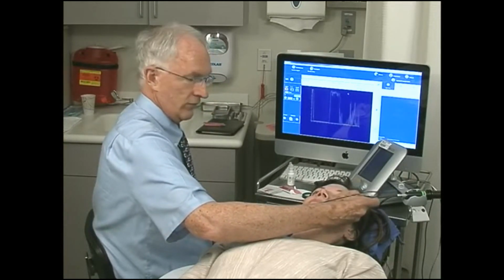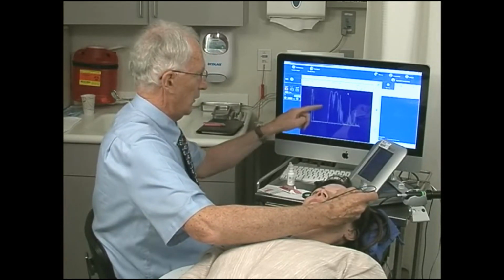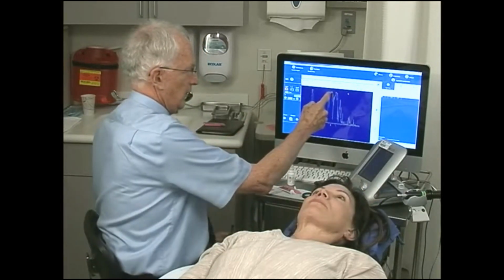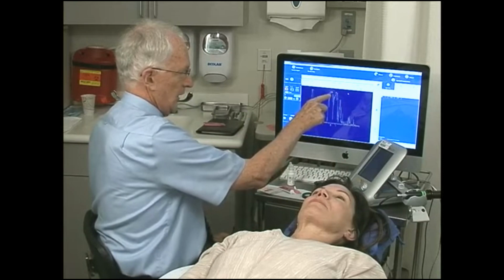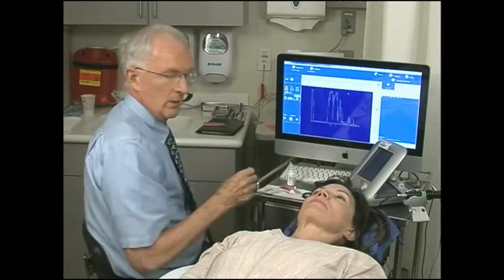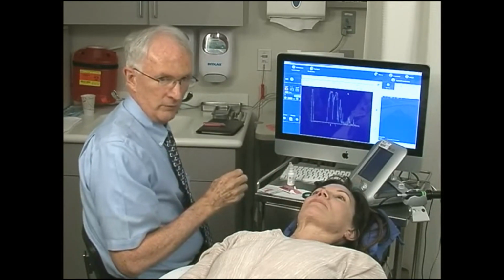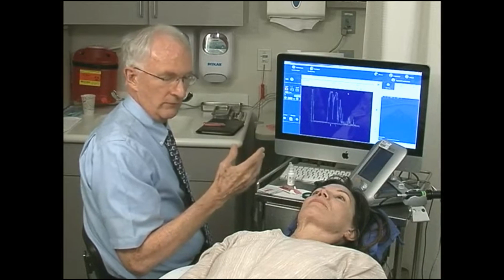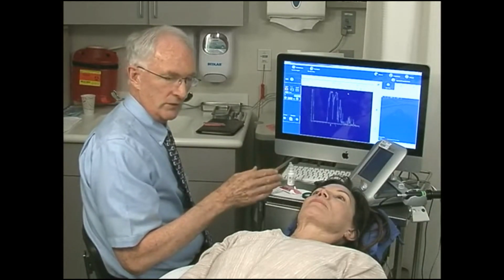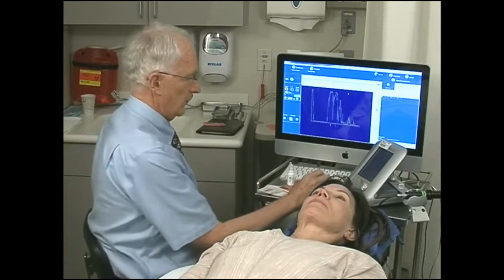I make little microscopic movements, side to side, up and down, and I watch for a dip in reflectivity. And when I freeze that, I can see the pattern here of the muscle compared to normal orbit, which is high reflective here, high reflective there, but here you see the dip in the pattern because the muscle is more homogeneous than adjacent orbital tissue. Again, normal orbit is quite high reflective because of many interfaces. The muscles are more homogeneous than surrounding orbit. They tend to be a little bit lower reflective normally.